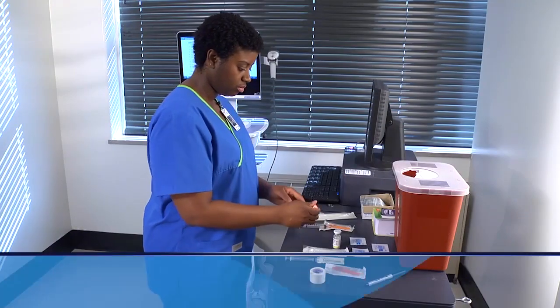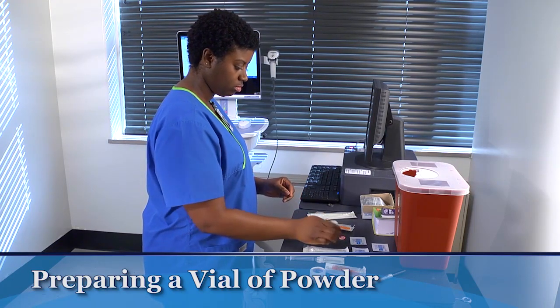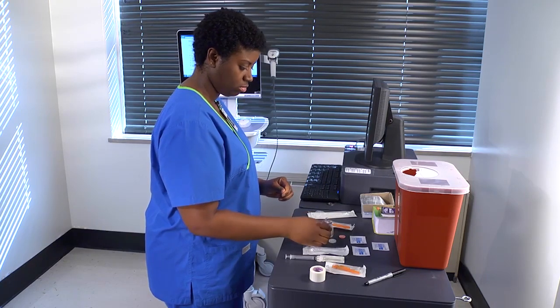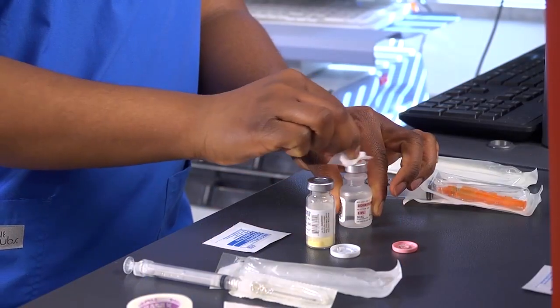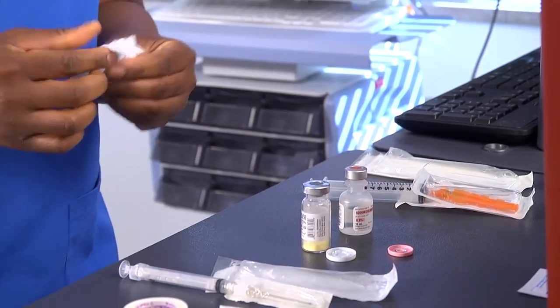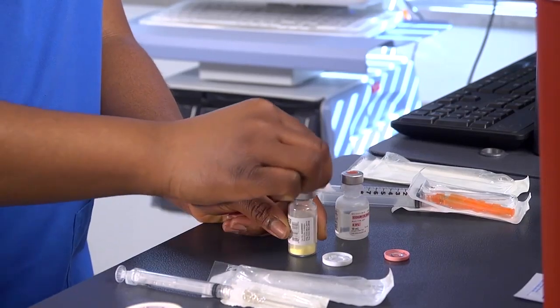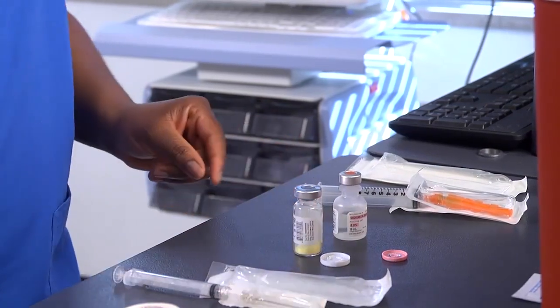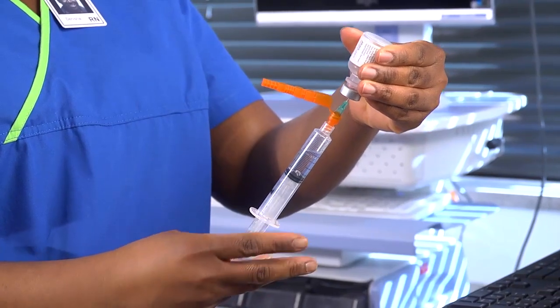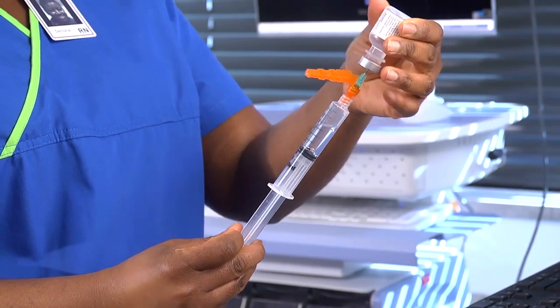If the vial contains a powder that must be reconstituted, remove the caps on the vials of medication and diluent. Be sure to check the manufacturer's guidelines for the correct diluent and volume of diluent to use, and if use of a filter needle is recommended. Wipe both rubber seals with alcohol. When the alcohol is dry, use a needle or needleless device to draw the diluent into the syringe as you would medication from a vial.